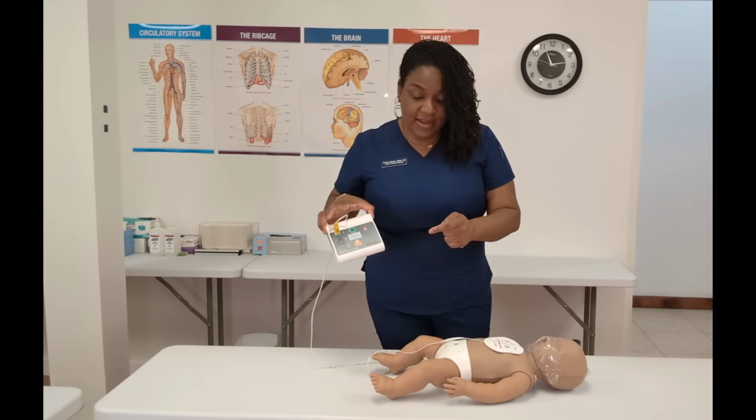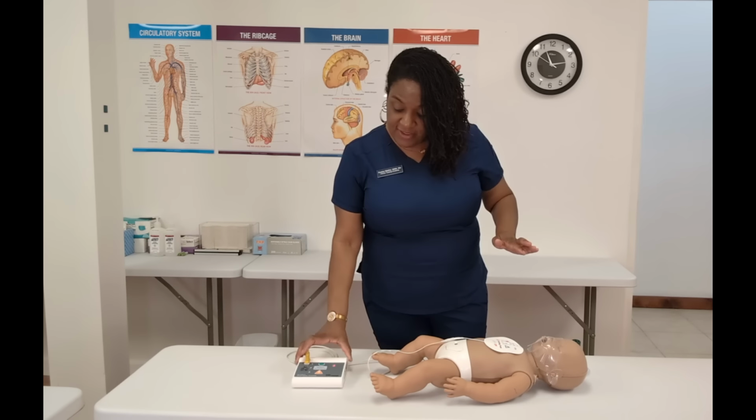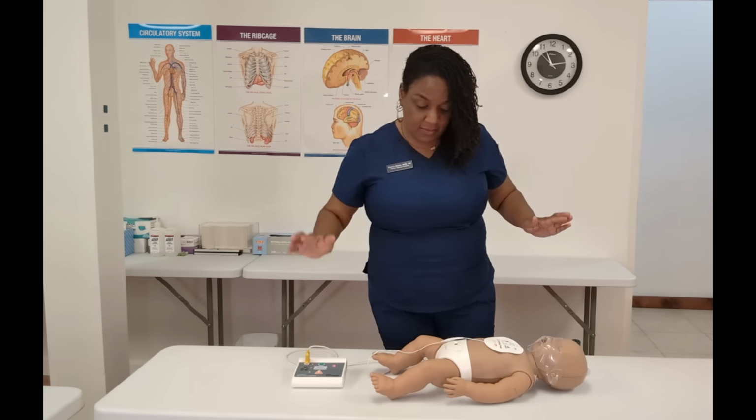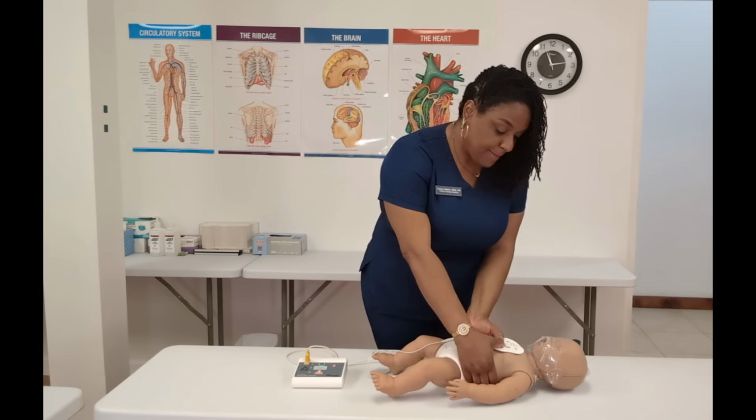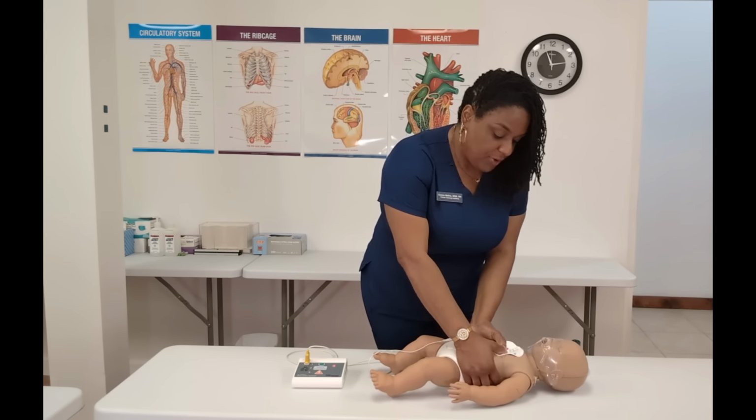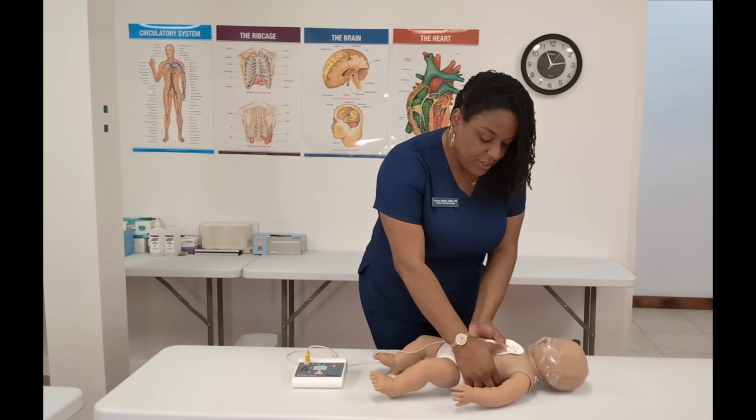I'm going to press the button that's flashing. Make sure you don't touch the infant while you're pressing this button. Shock delivered. I go right back into my chest compressions. Begin CPR. 1, 2, 3, 4, 5, 6, 7, 8, 9, 10, 11, 12, 13, 14.